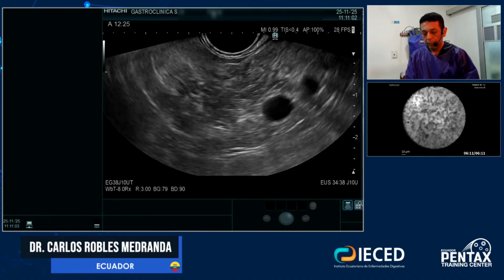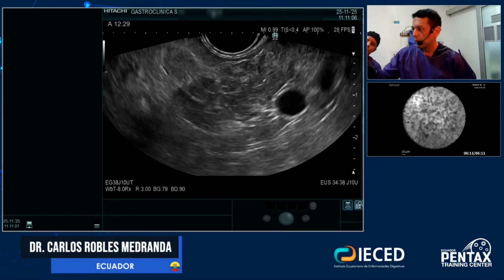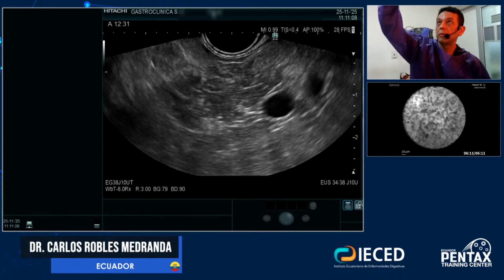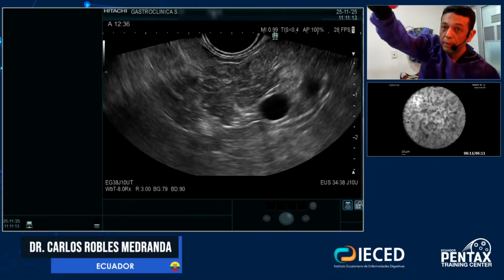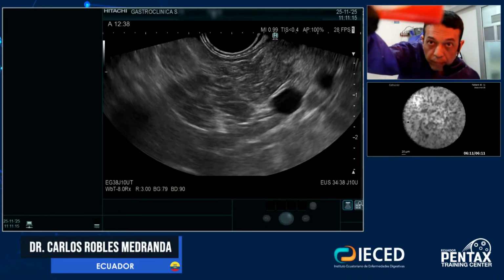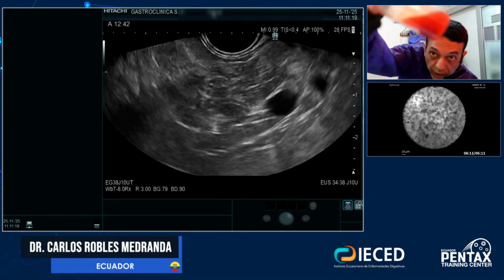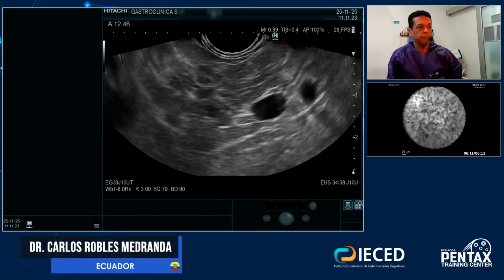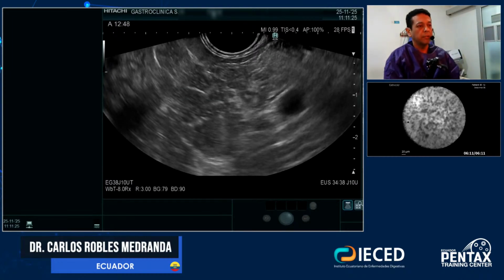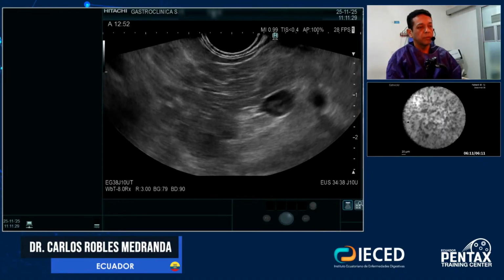So we have very good tissue now. Yes, we have a very good tissue, huh? Okay, you see there. Okay, perfect. This is a very good tissue. I will finish my case today. Okay, it is okay.